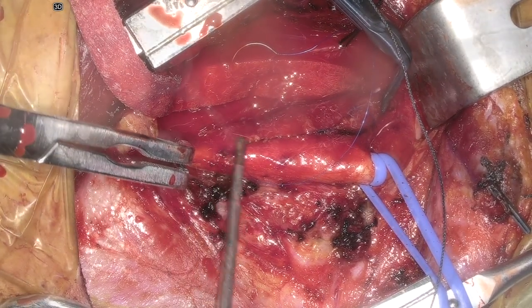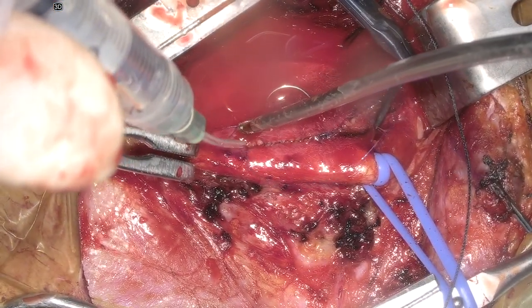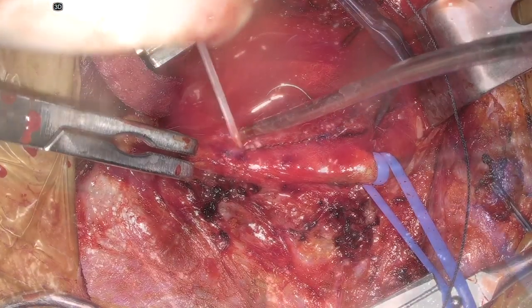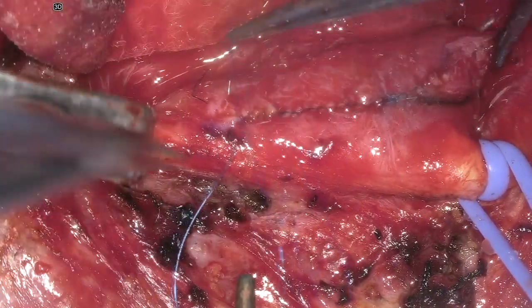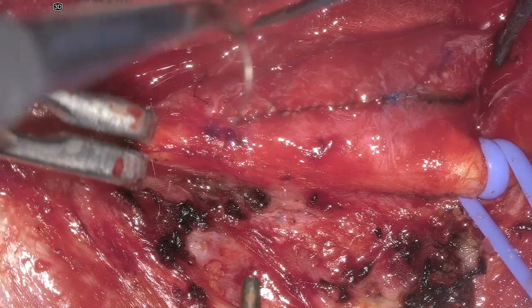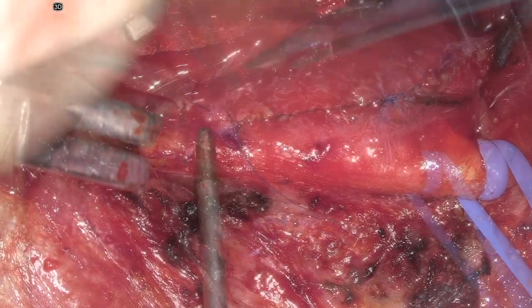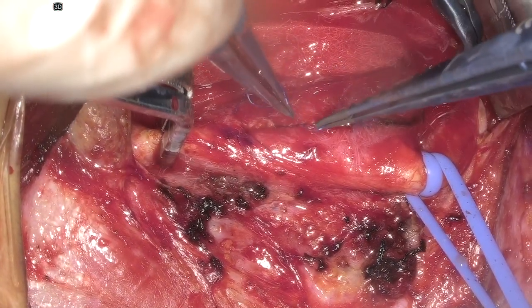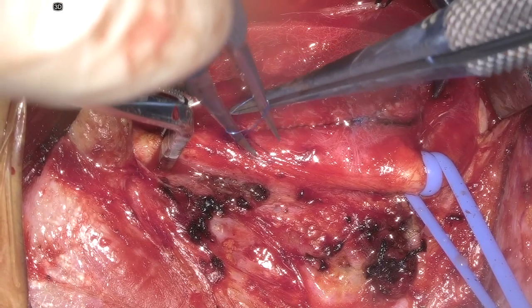These are the last few stitches with the 6-0 prolene. We tie this off and then recirculate.